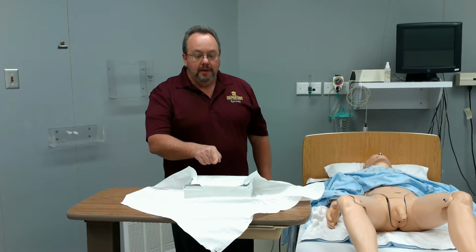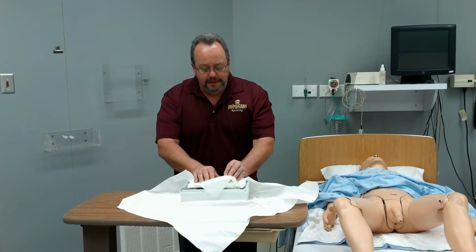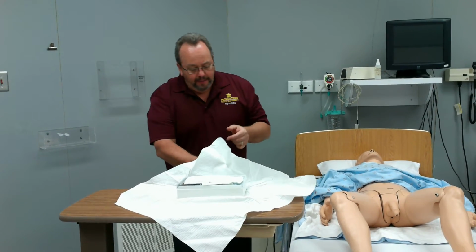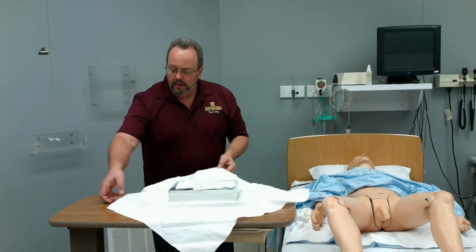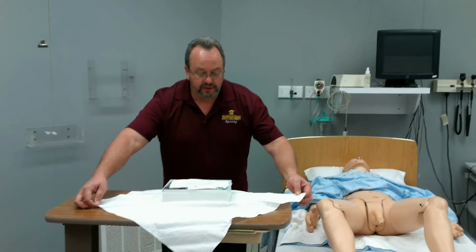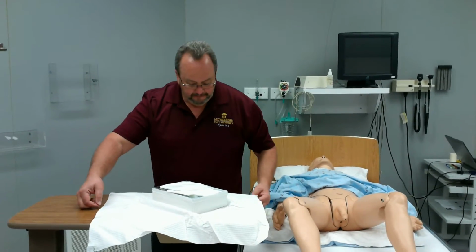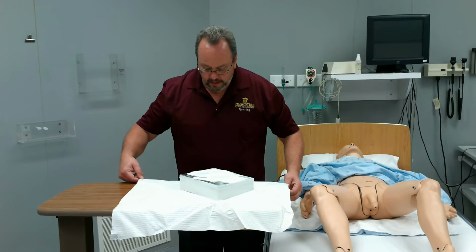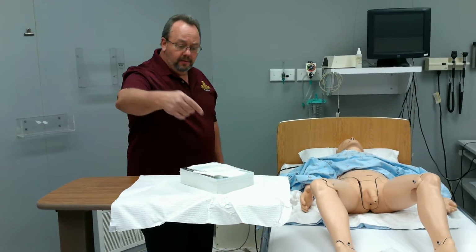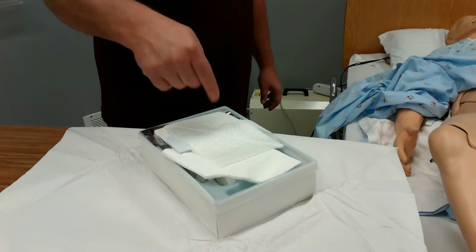This last flap, I'm not going to reach into my sterile field to get it. I'm going to simply pinch it from the back here and pull it toward me, and then use my 1-inch border to flatten and straighten. And I will straighten this so that it is straight on my table, like that.